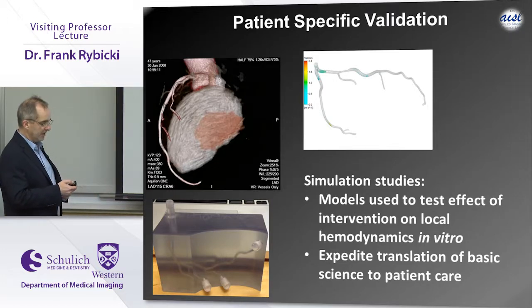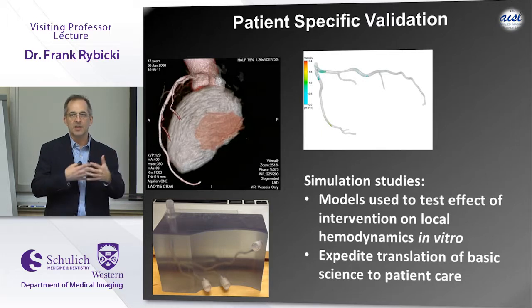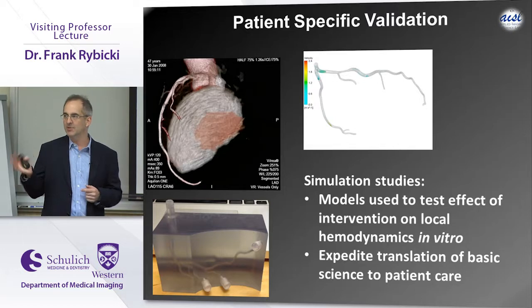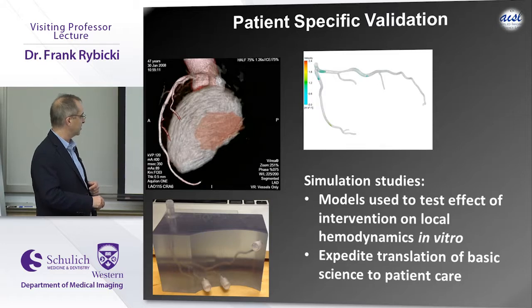So this is a coronary artery, and I don't know if people here have heard of CT FFR or HeartFlow, or the types of things where you actually get physiologic information from just straight up anatomical data. Well, you can't actually test those things by taking someone's heart and doing 1,000 scans on them, right? But you can take someone's coronary arteries. This is just a 3D printed model of someone's coronary artery.